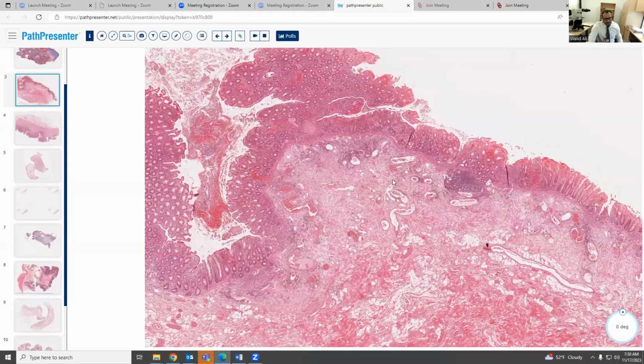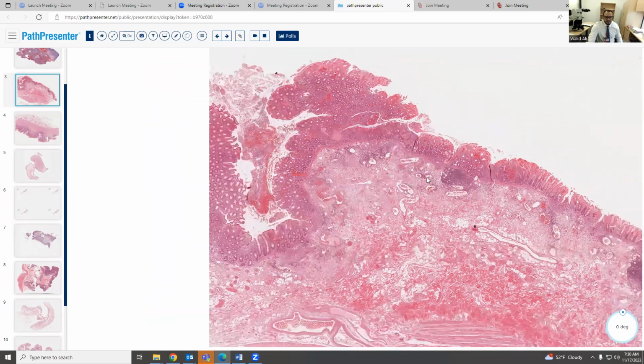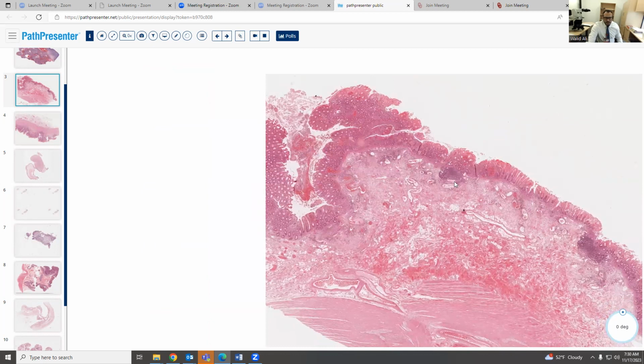First thing is to diagnose ulcerative colitis. It usually is superficial, or it doesn't involve the whole thickness of the colon. It's not transmural. It happens superficially. Like here, if we look here, we can see the inflammatory cells involving the lamina propria or the epithelium, and then the submucosa here, but it never goes down to the muscularis propria or the subserosa.